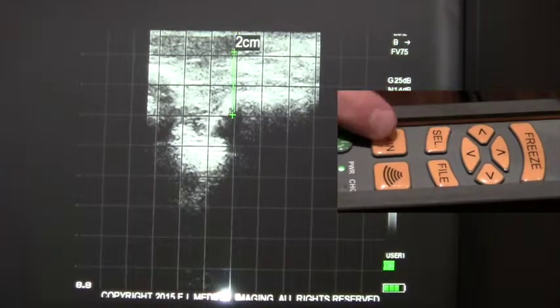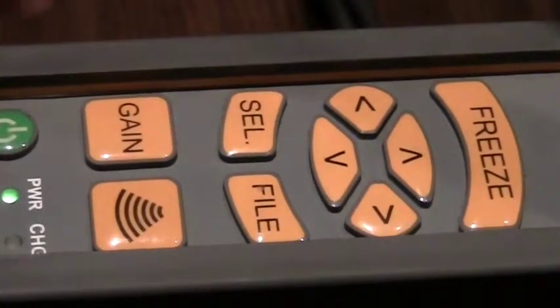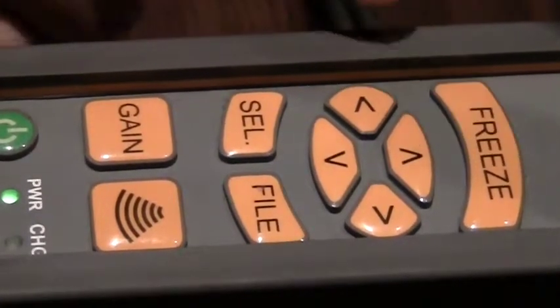Once you have it positioned correctly, hit select to set your measurement. Freeze will then exit you back out to live scanning.